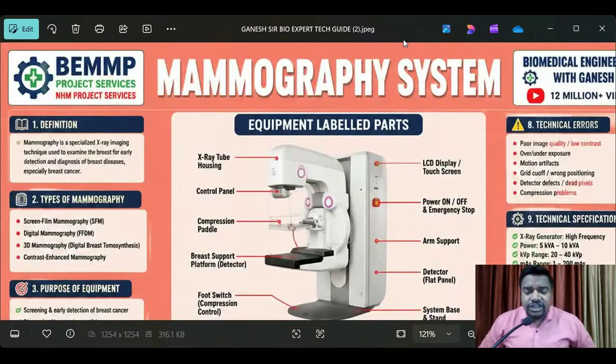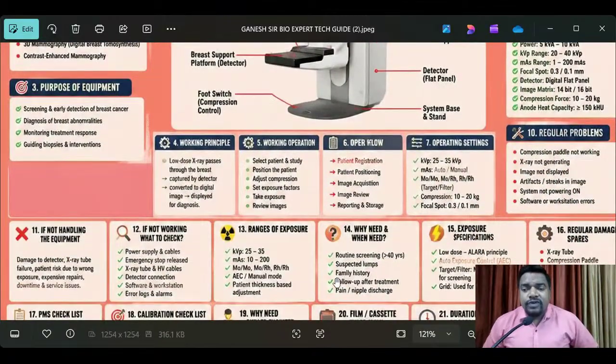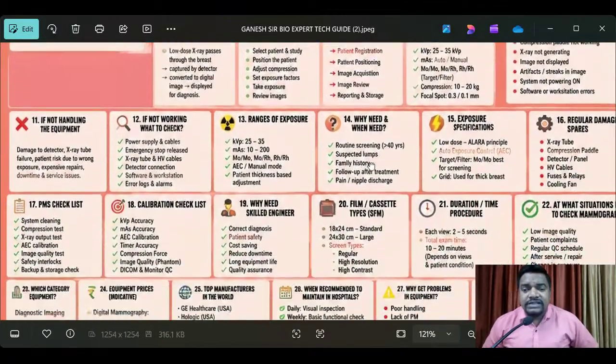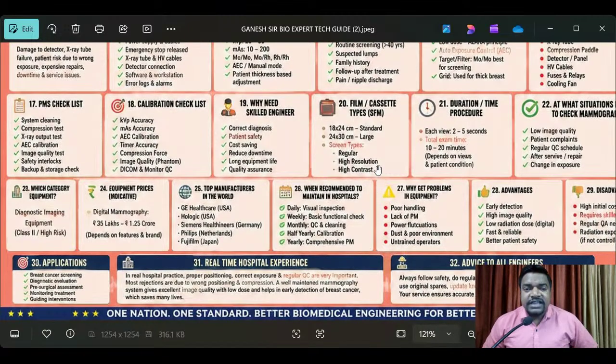Right now in this slide presentation, my dear engineers and students, listen carefully. Whoever engages, definitely, it is a professional YouTube biomedical channel. And in mammography, see here, many topics and many points I'm going to discuss and share with you all. These are all very valid points for biomedical engineering services. If you are working as a biomedical engineer, what things are important, technically, non-technically, mechanically, and in troubleshooting, and if you get any complaint, what problems will come.